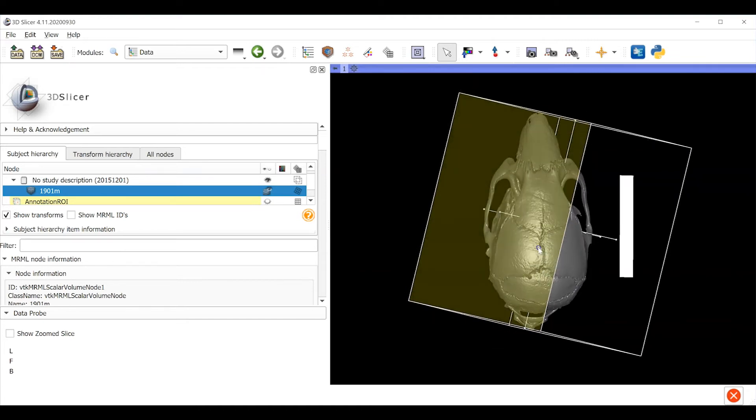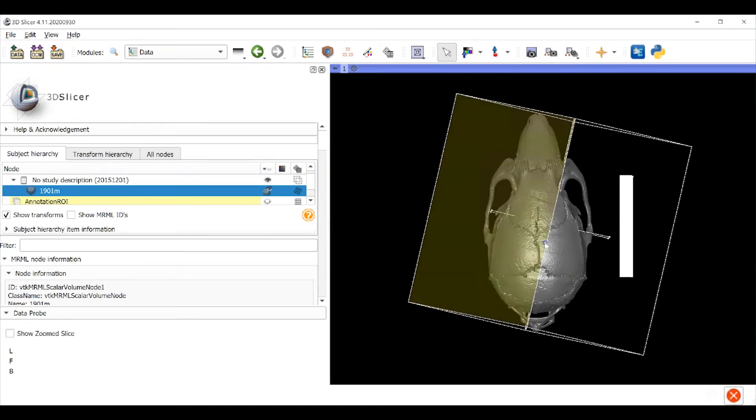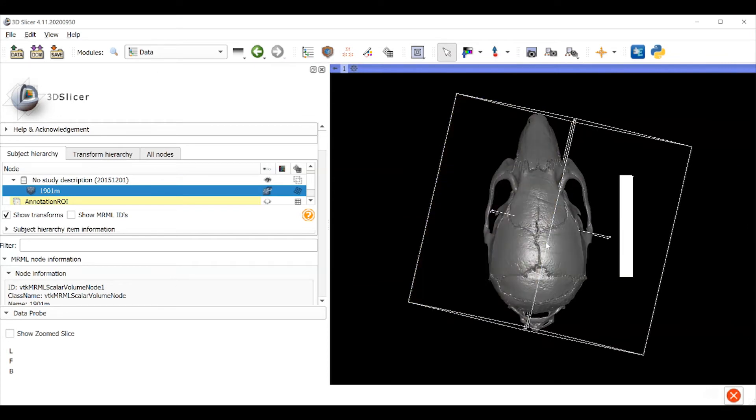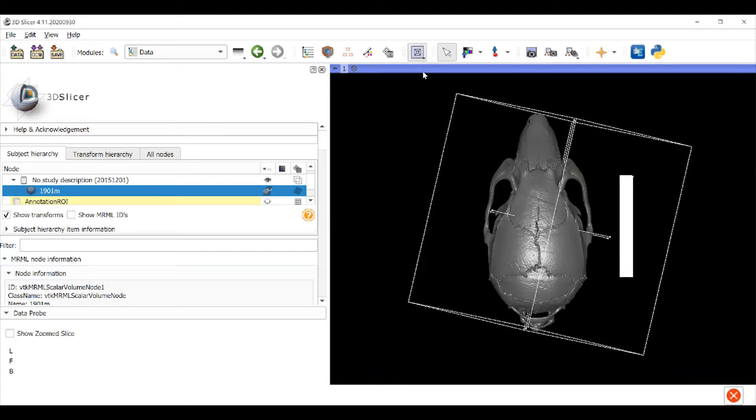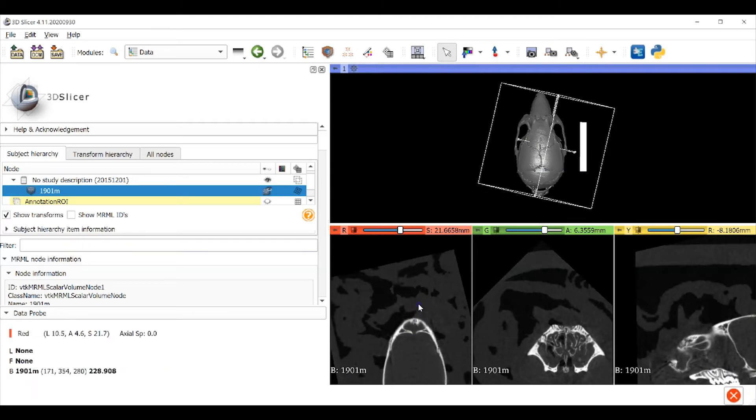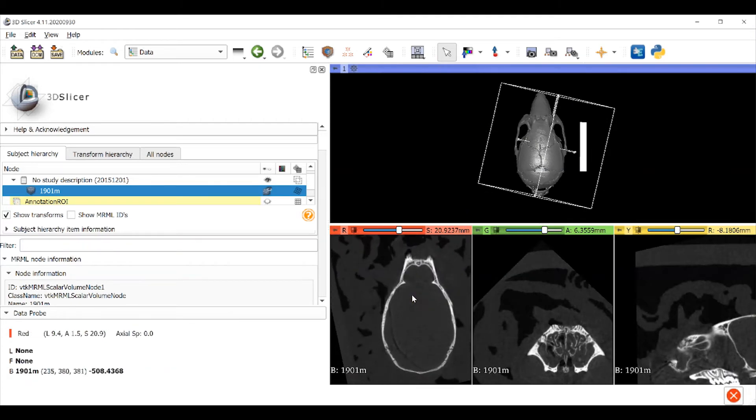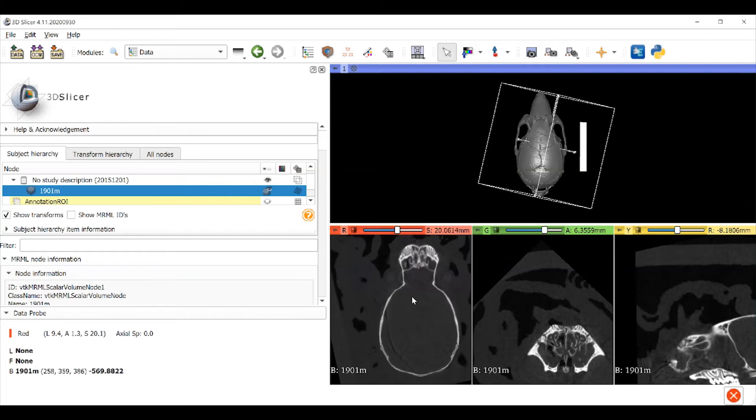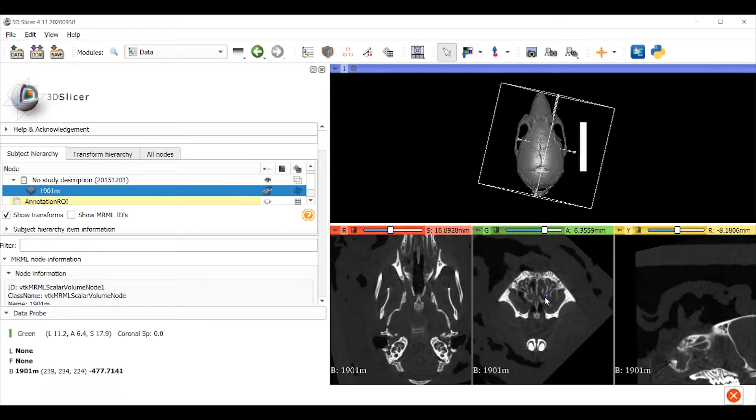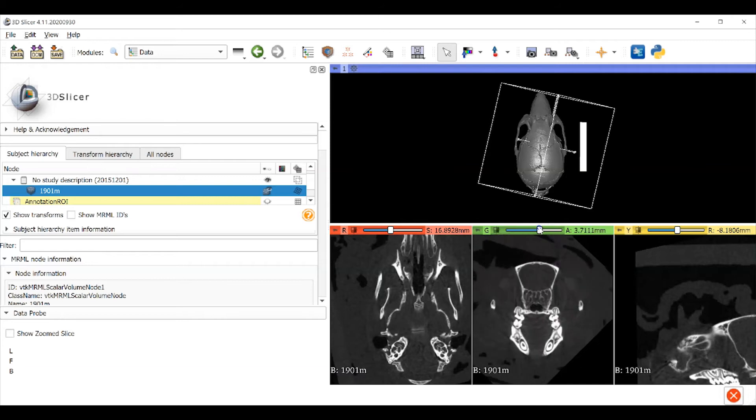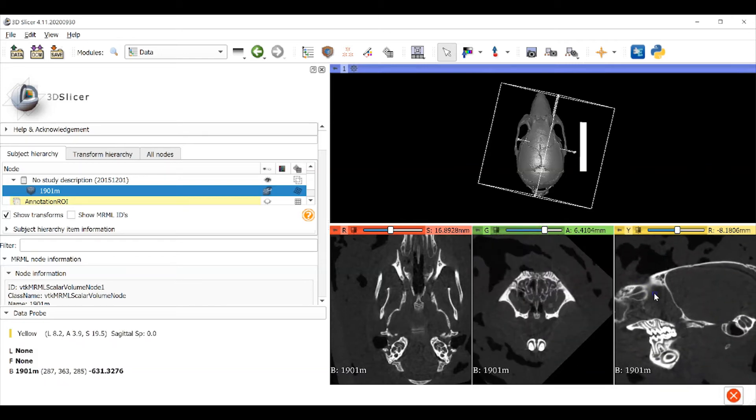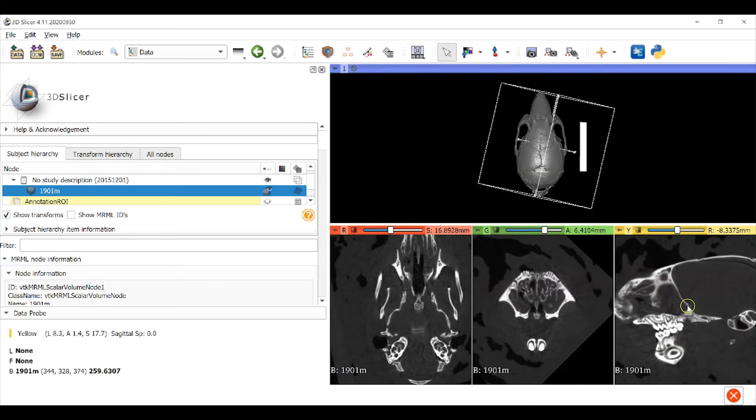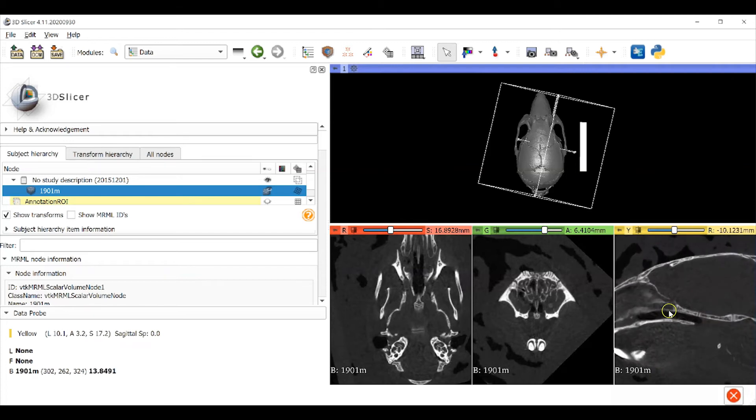So to tilt the model to the left, I'm going to wiggle the model in little circles to the right. And now we can return to a conventional layout for the viewers and confirm that our 2D slices more closely represent the orthogonal planes of this skull. I'm going to shift left click to pan, scroll wheel to move through the slices, or you can drag the handle at the top of the window to jump around. And here we're able to see that we have a pretty good mid-sagittal view of this skull.